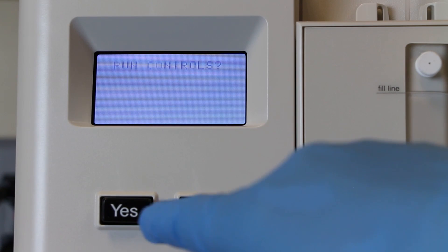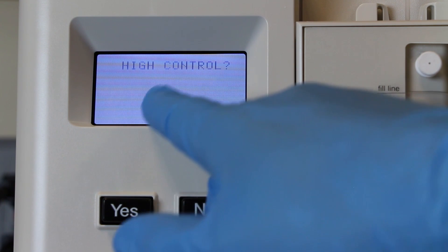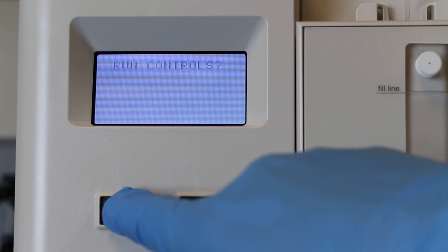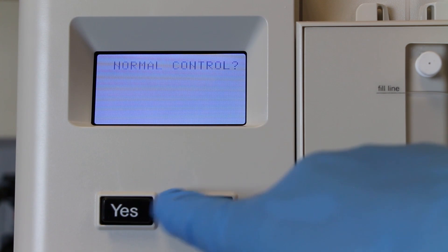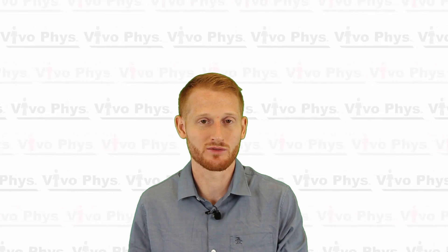When it asks if you want to run a normal sample quality control, say no. It's going to ask if you want to run the abnormal high — say yes, run that sample, then go back. It will ask if you want to run a normal — say no. It will ask if you want to run an abnormal high — say no. Then it will ask if you want to run the abnormal low — say yes. You do that three different times to run each of those levels of quality control.